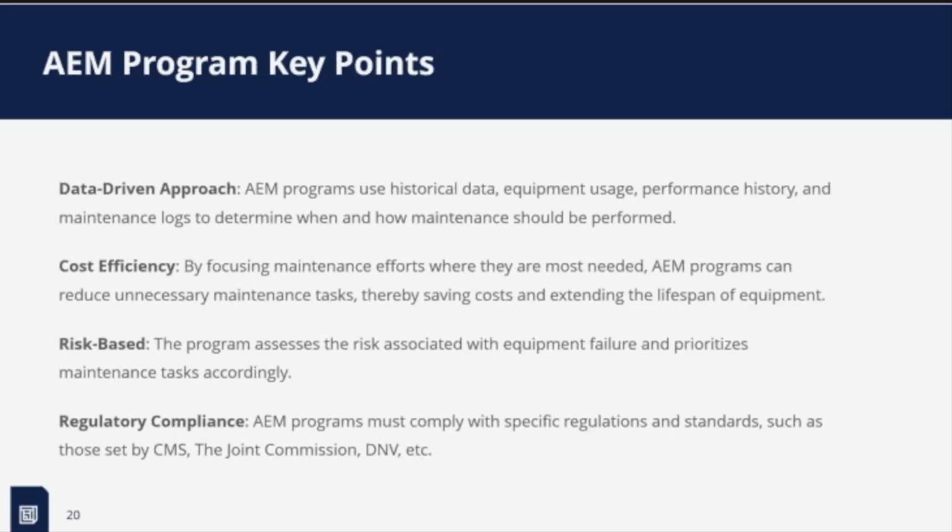Your programs must comply with the regulations, those set by CMS, the Joint Commission, which now I just heard it's not "The Joint Commission" anymore, they took the "The" away, so it's just Joint Commission. They're trying to be strict on that. And then DNV. I was just at a talk with them earlier in the week.